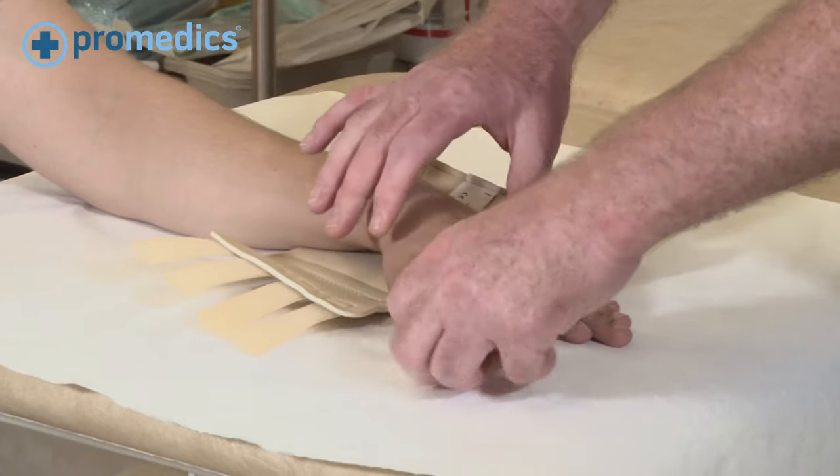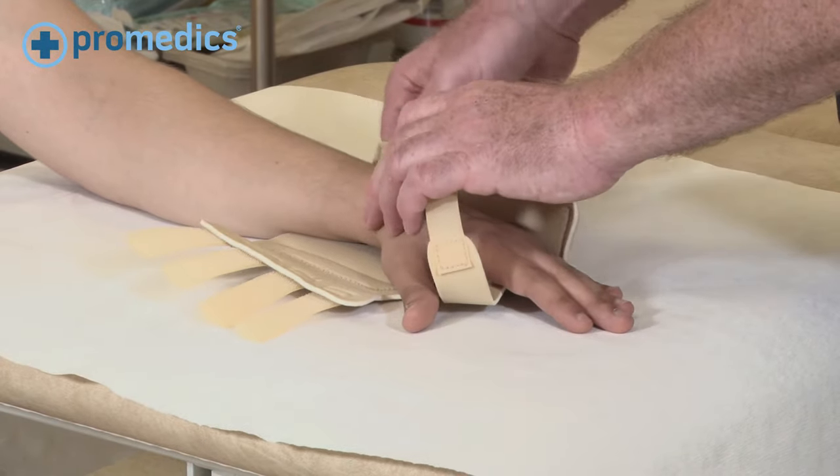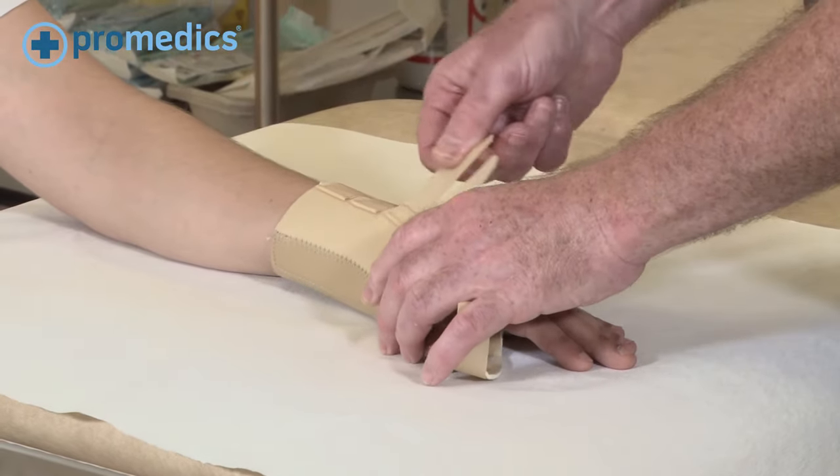Position the brace underneath the patient's arm and apply the straps firmly, but obviously not too tight.